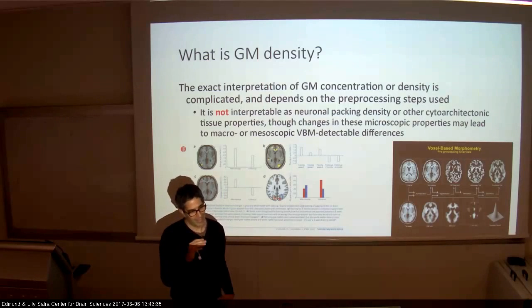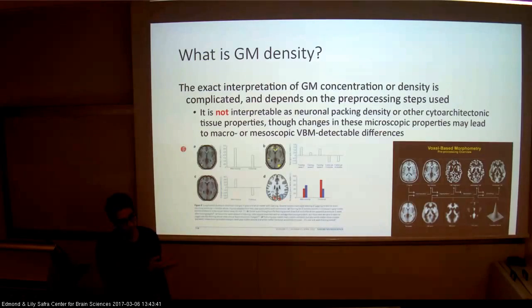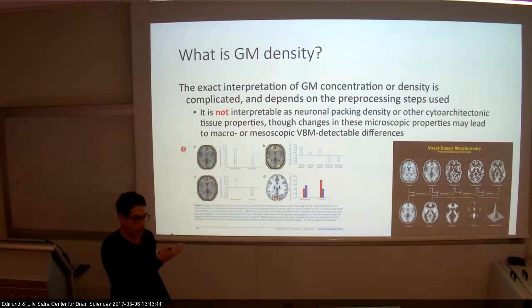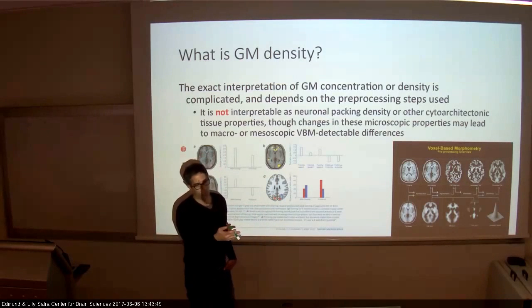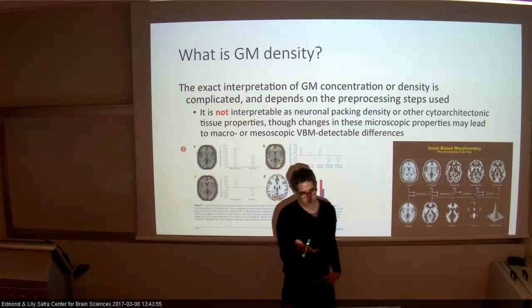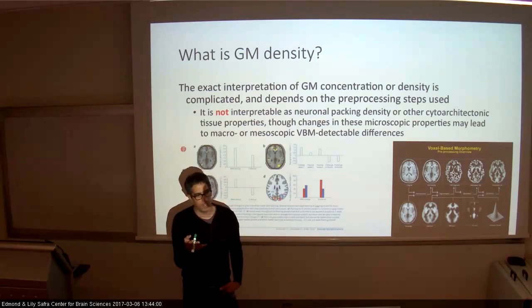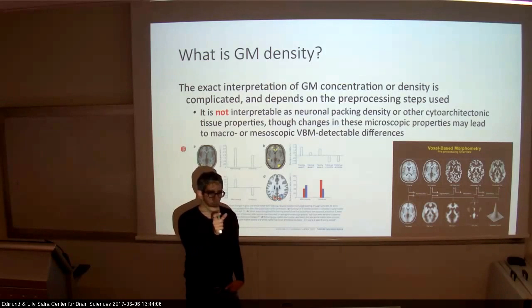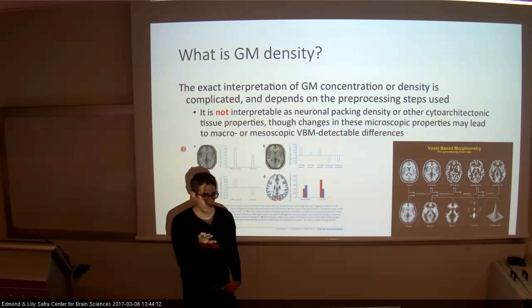You're saying there's a difference, but you don't know what it means. So what does it tell you? For instance, in here it means that there is a difference in this position or around this position, grossly around this position, by learning to do juggling. Or maybe it was about Alzheimer's. You may say there is some difference in the hippocampus that you couldn't maybe tell before, or that it exists. Or you can say that the effect is changing with the progression of the disease, and there is a critical period of progression, and so on. You can say many things. You cannot be very specific of what it is. Also, not exactly where it is. Kind of bulky where it is.